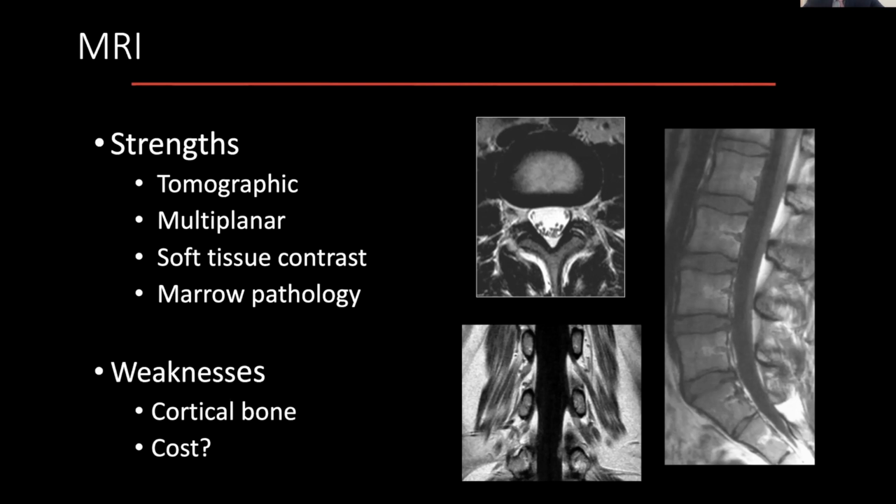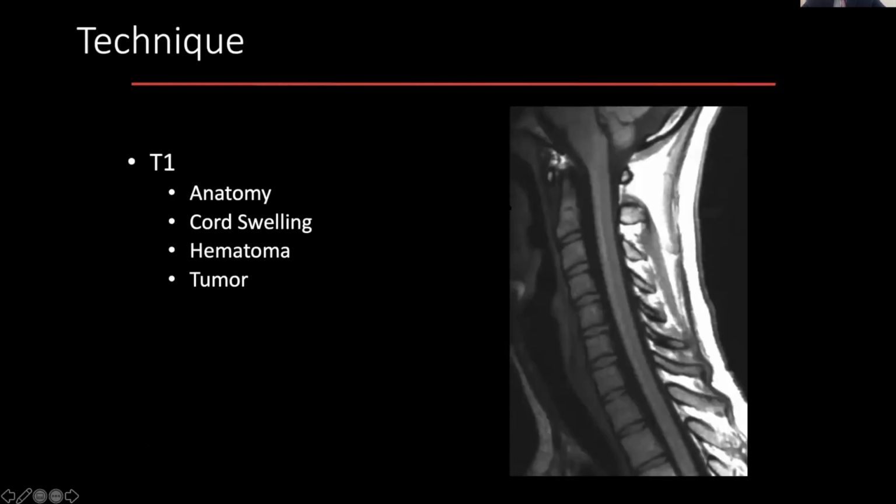If you're interested, you can look at things like compressed sensing, which is technology from the IT world, also called sparse data set evaluation, and that really allows us to accelerate, or reduce the amount of time that we need to acquire a data of MRI.